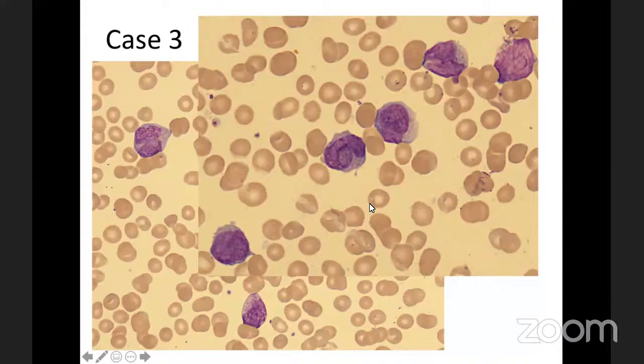So with the very high leukocytosis, this is going also with the microvariant of M3. It's known that the microvariant will have increased leukocytosis to hyperleukocytosis, together with similar abnormal coagulation profiles and fibrinogen and others.